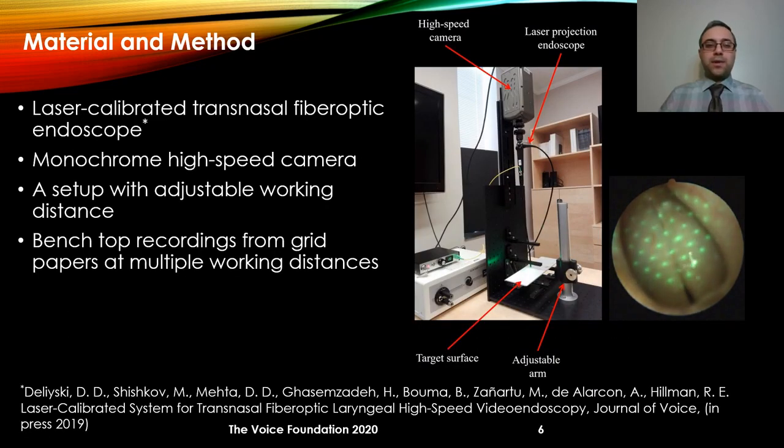So for this study, we used a laser-calibrated transnasal fiber optic endoscope that was connected to a high-speed camera. And then we used a setup with adjustable working distance. Basically, this arm could go up and down, and that would change the distance between the endoscope and the target surface. And we collected a set of benchtop recordings from grid papers at multiple working distances.